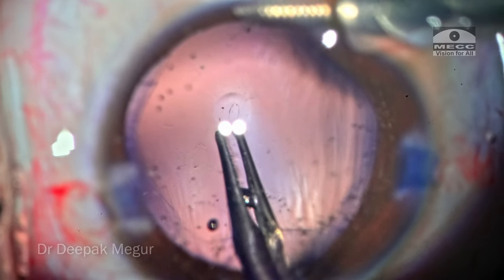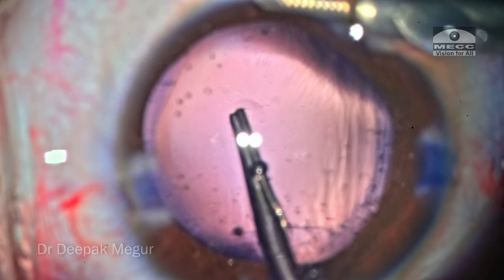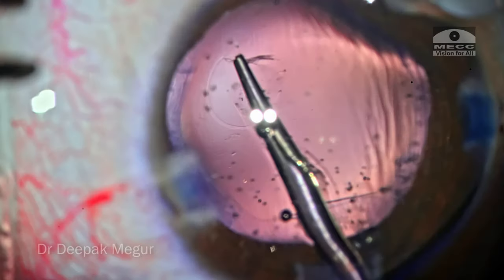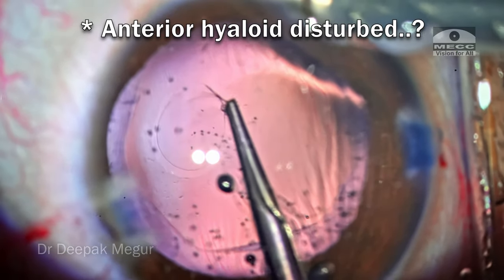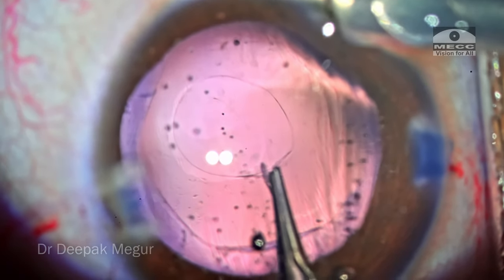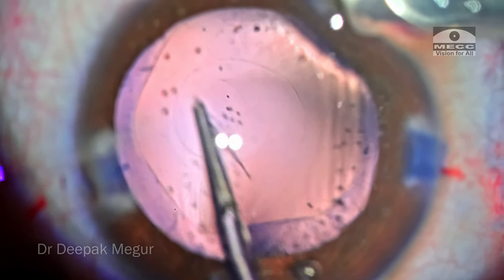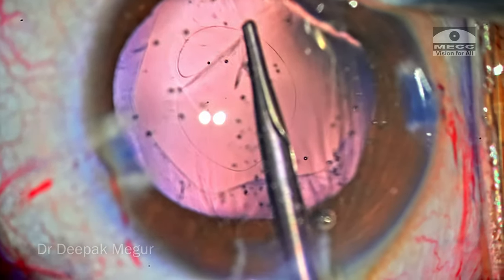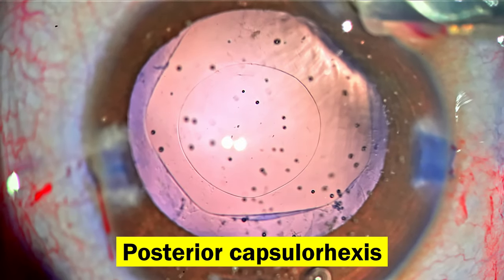Having a good pair of forceps is extremely critical when doing rhexis, especially posterior capsule rhexis. One of the torn edges is held by the forceps and gradually the rhexis is initiated. The posterior capsule is much thinner than the anterior capsule, and elasticity is almost the same. The most critical aspect is you need to see well. Thankfully in this case the visibility is great. I'm aiming for a rhexis of about 3.5 to 4 mm in size. Slowly but surely, the posterior capsular tear is converted into a posterior capsule rhexis and it appears to be quite well centered.